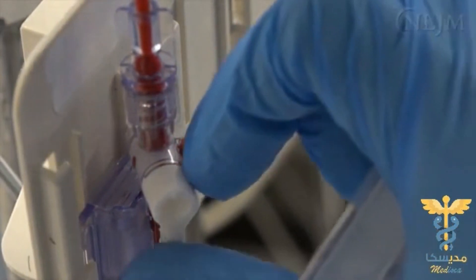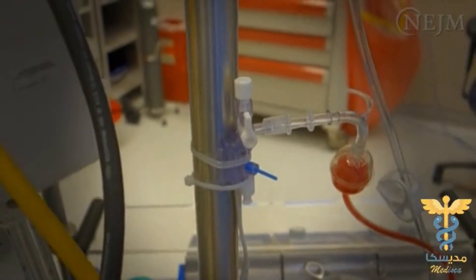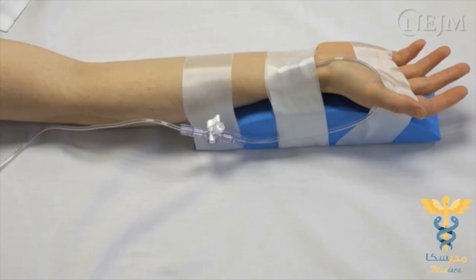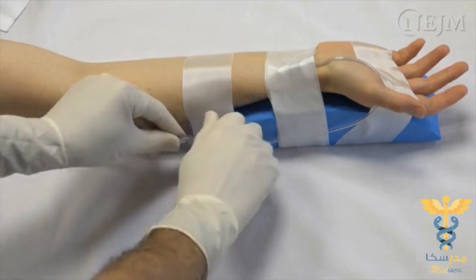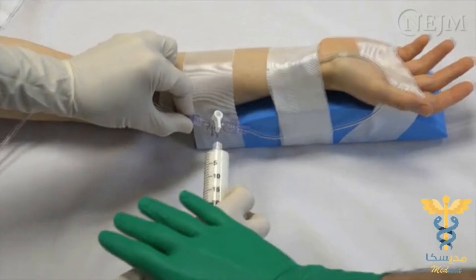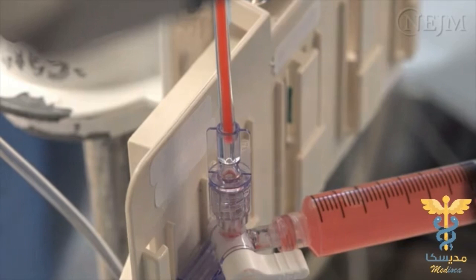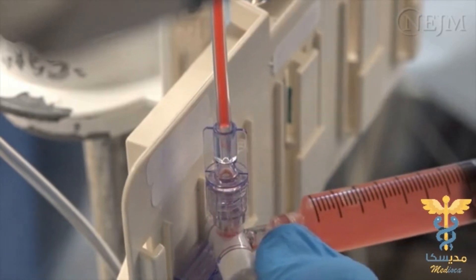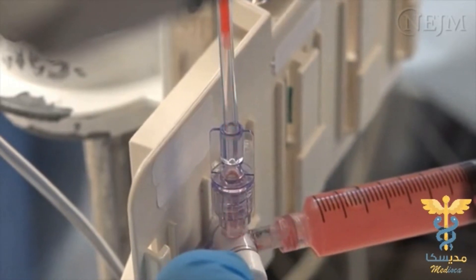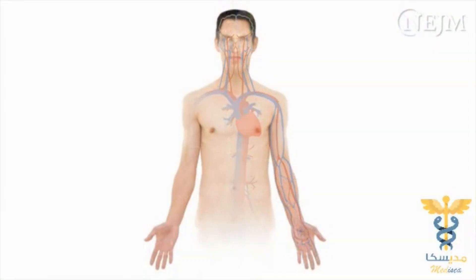If the transducer system is connected to a central venous catheter, the patient is at risk for either hemorrhage or venous air embolism, depending on the position of the catheter relative to the heart and the central venous pressure. It is therefore essential to ensure that all tubing connections are secure and that stopcocks are placed in visible locations. Pressure transducers connected to an arterial cannula pose additional risks: the risk of accidental intra-arterial administration of an intravenous medication is greatly increased. Any contamination or air in the line can be inadvertently flushed directly into the arterial circulation. A rapid flush or injection can create a brief retrograde flow in the arterial tree that could allow emboli to travel to the cerebral circulation.